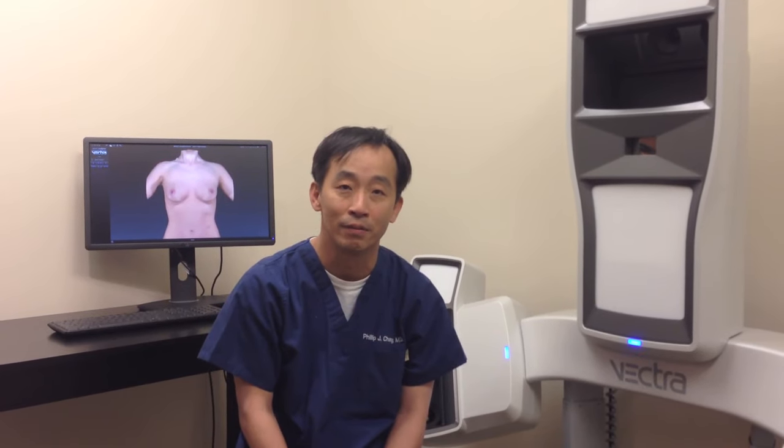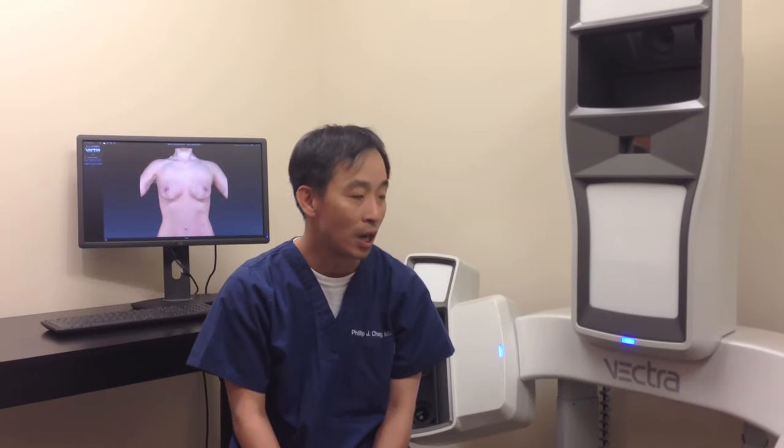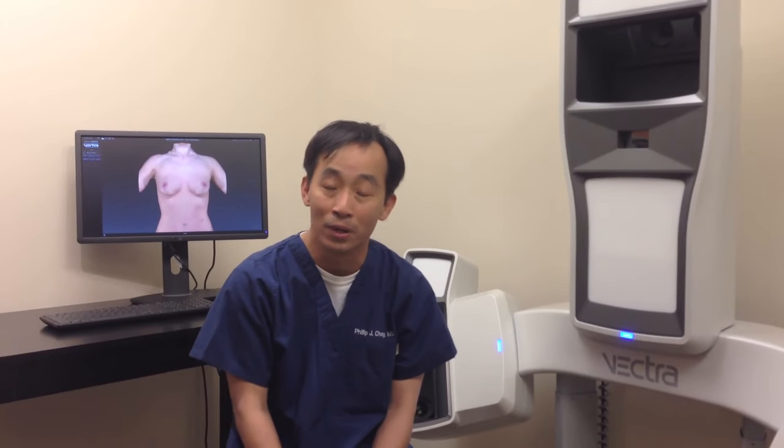So, for example, we can take pictures of a patient before and after a breast augmentation and basically show the patient what they might look like before a breast augmentation.